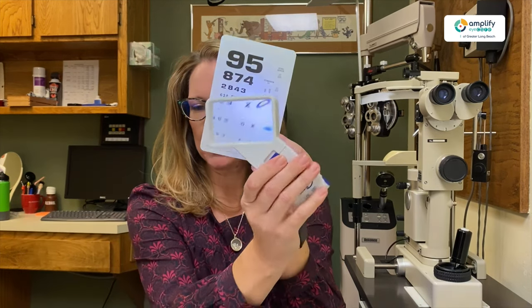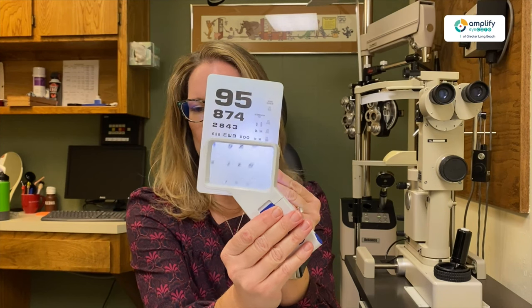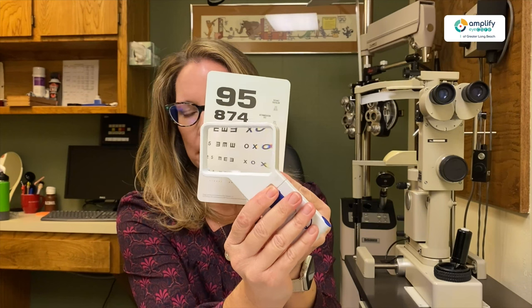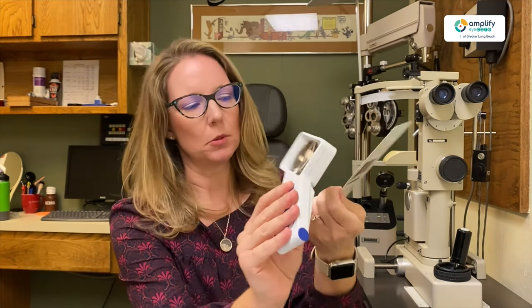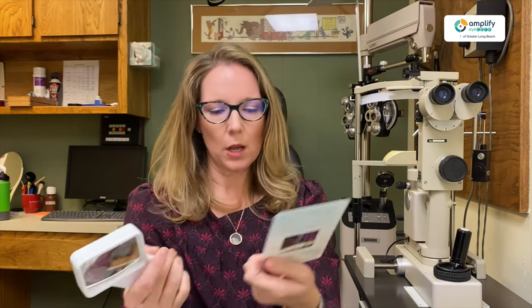But then we can even get into handhelds that have lights as well. Now this is a little bit higher power, so you can see the window is a bit smaller already. But it does give you that light versus without the light. Right now there's some glare, but it does help when you actually have something with a darker background as well.